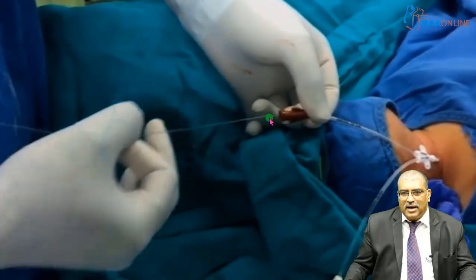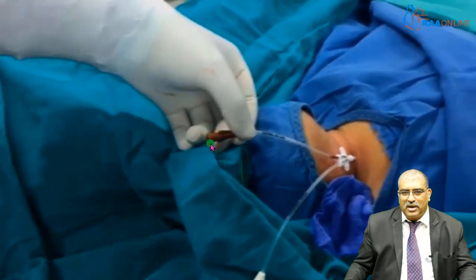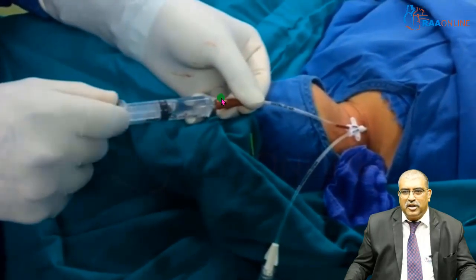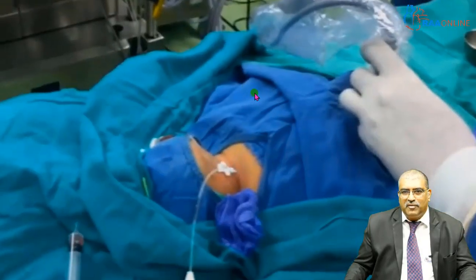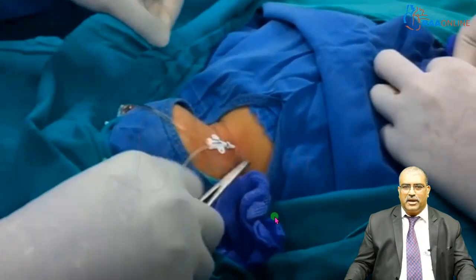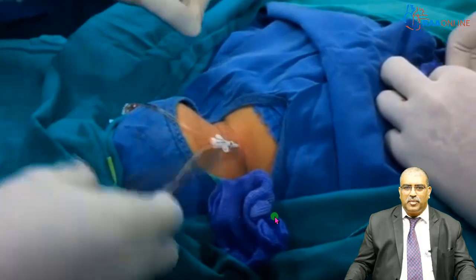Now you have to aspirate and flush. You will connect a 10 cc syringe and aspirate. See, now you aspirate and there should be free flow of blood which comes in, and it has to be fixed properly. That is very important.